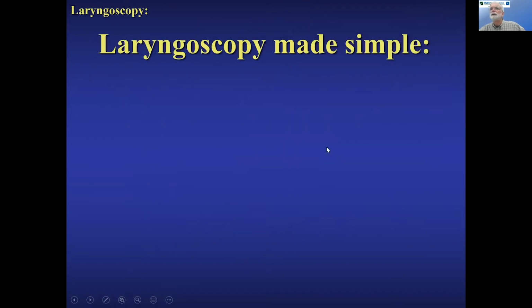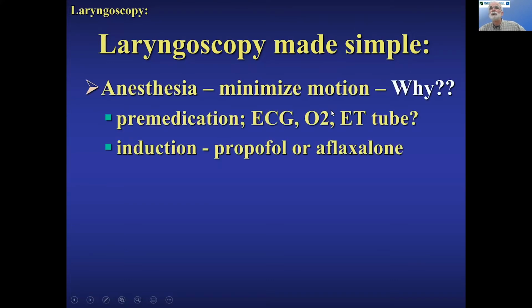All right, so here we go, Dave, making it simple. The simple thing is that we need to minimize motion.